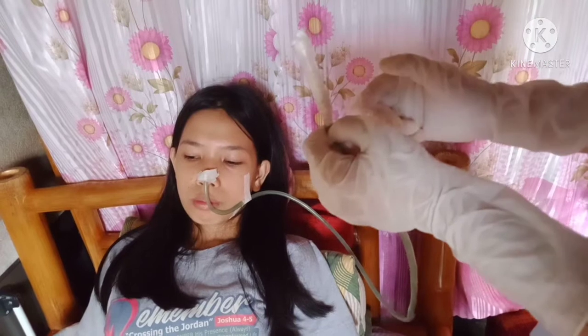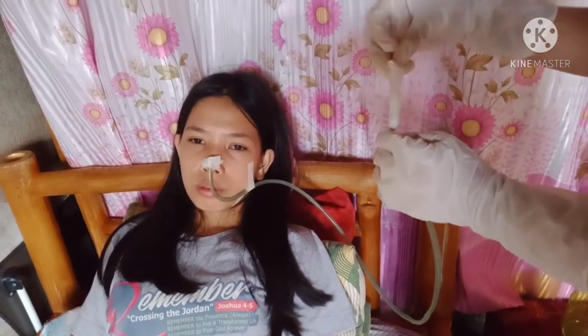After that, we have to initiate feeding. Initiate bolus or intermittent feeding. Pinch the proximal end of the feeding tube. Remove the plunger from the syringe and attach the barrel of the syringe to the end of the tube. This prevents air from entering the client's stomach.